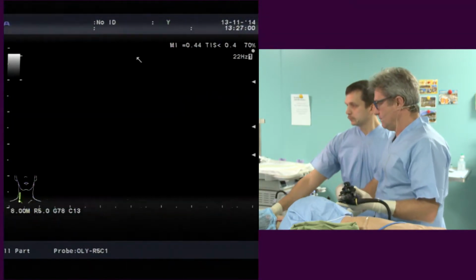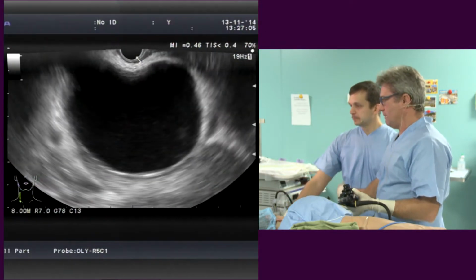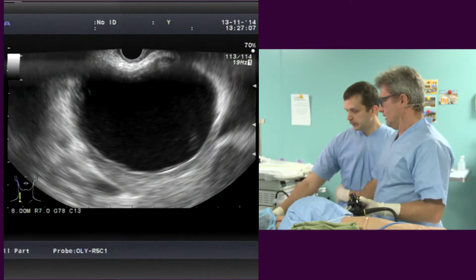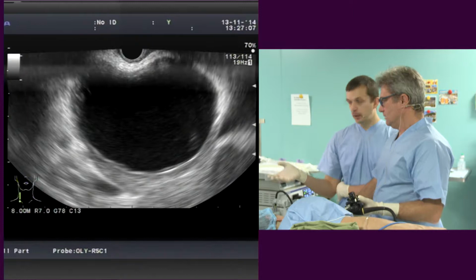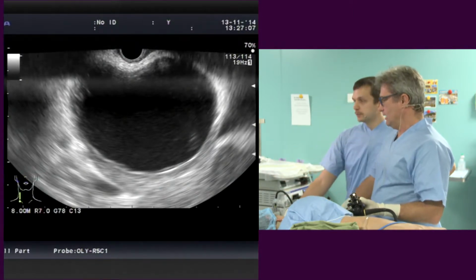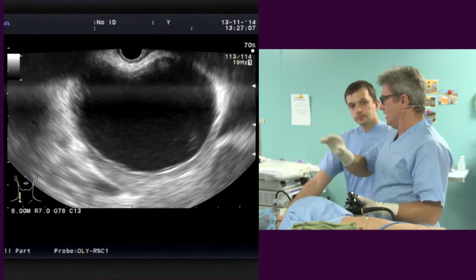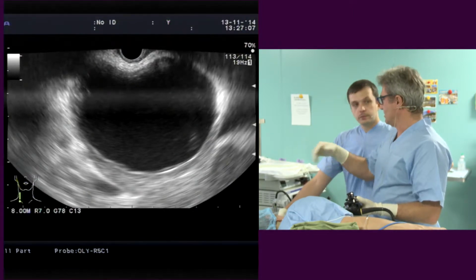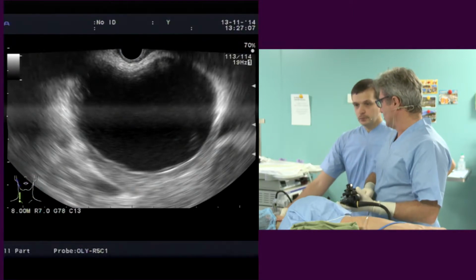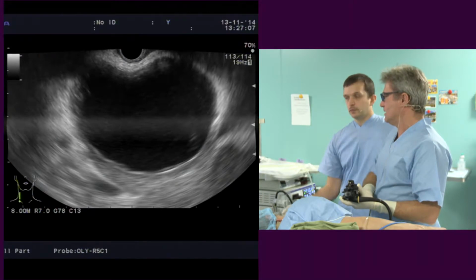Okay, so let me see. So this is probably a pancreatic pseudocyst. What do you think about the wall of the cyst? Do we need to measure it? Do we need to examine? So I think what is important is, this was not there 2 months ago, okay? So this means that something happened, and this is an evolution of the episode he had 2 months ago. So this is basically a consequence of his acute pancreatitis.